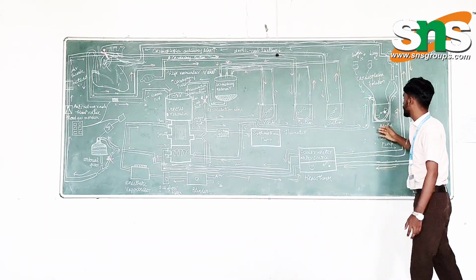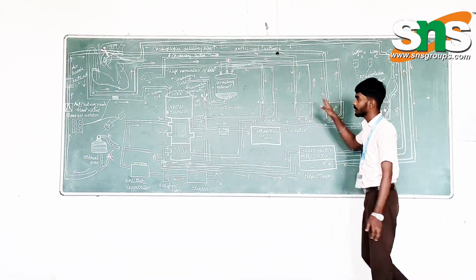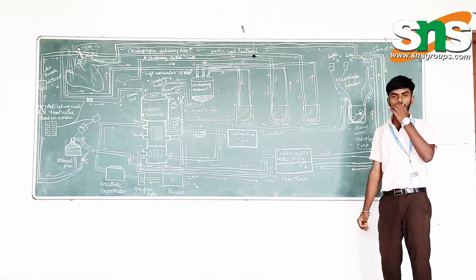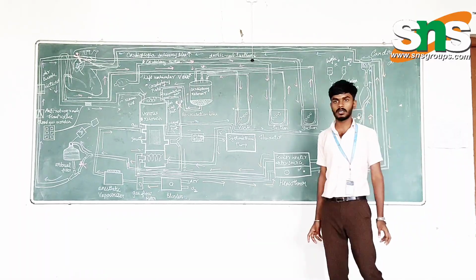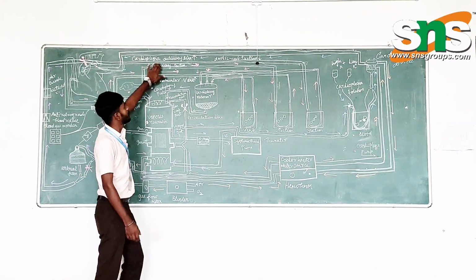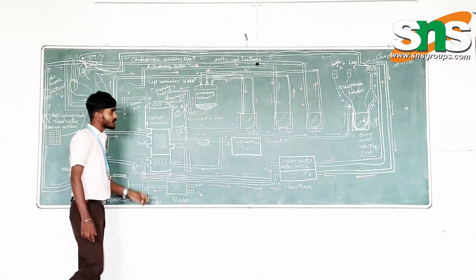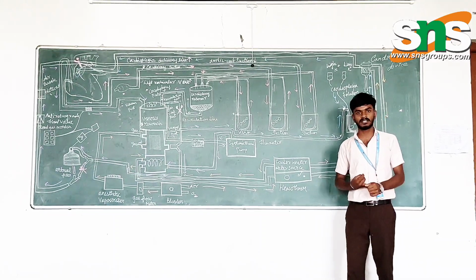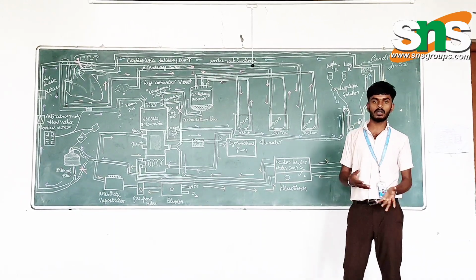Next, the cardioplegia device. The cardioplegia pump receives the blood from the oxygenator. Cardioplegia solution is given to the heart to arrest the heart. It is delivered by the cardioplegia delivery line. There are 3 types of cardioplegia solution: St. Thomas, Custodiol, Del Nido. These solutions are chosen according to the duration.